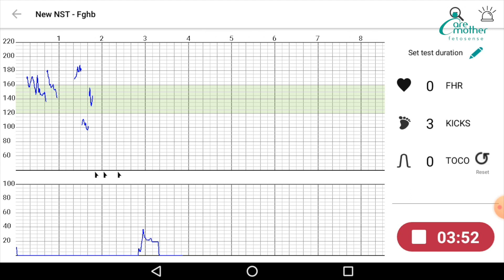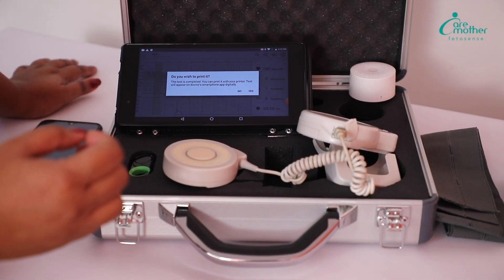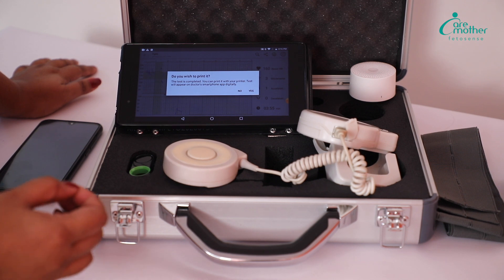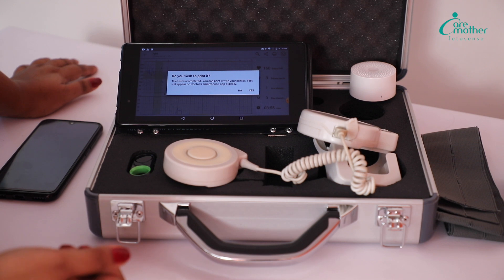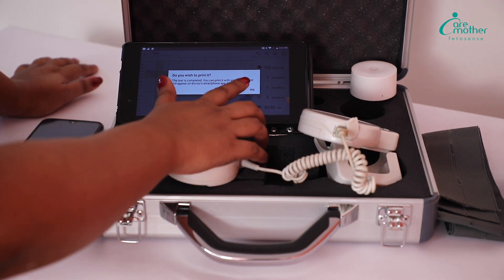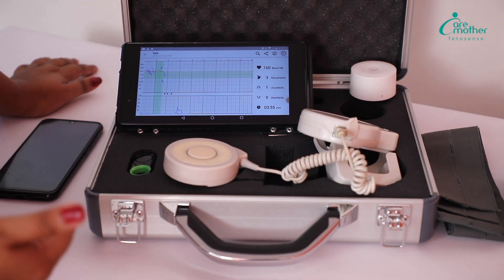Once the test is done, to stop it you simply press the red button and the test will stop. At this point, the device will ask whether or not you want to print the test. To print, say Yes — it can be connected to any printer in your facility and does not require thermal paper, so you can print a normal A4 print. If you don't want to print immediately, say No, and the test is autosaved as a PDF on the device.